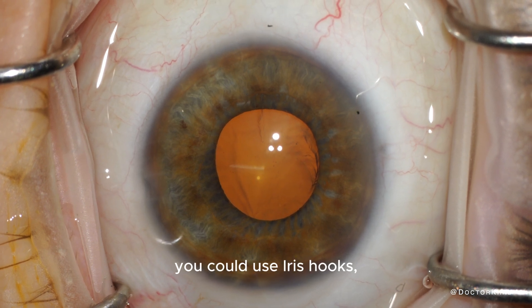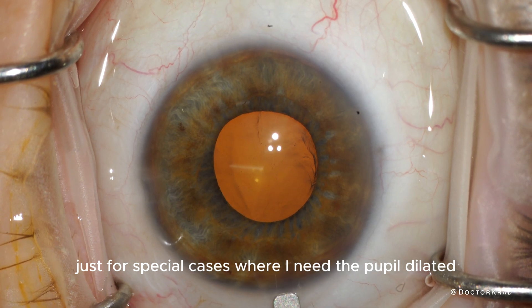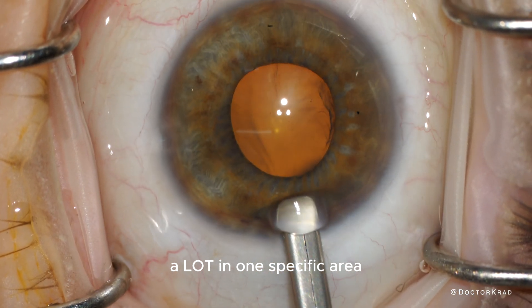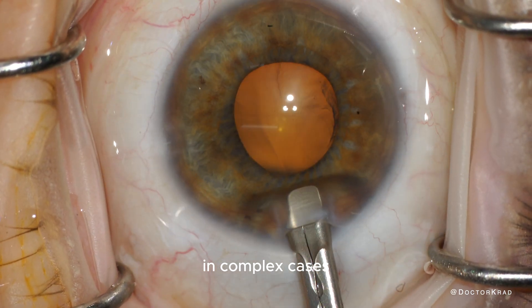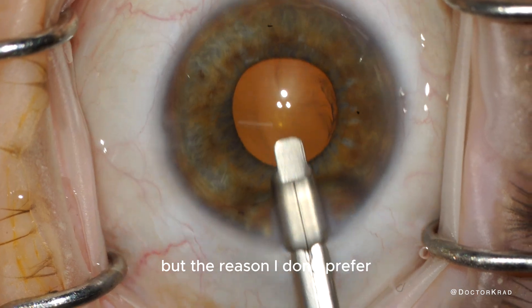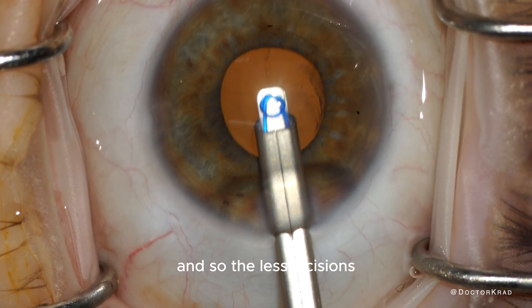You could use iris hooks, but I typically reserve those for special cases where I need the pupil dilated a lot in one specific area in complex cases. The reason I don't prefer iris hooks is because you have to make more incisions, and the less incisions, I think the better.